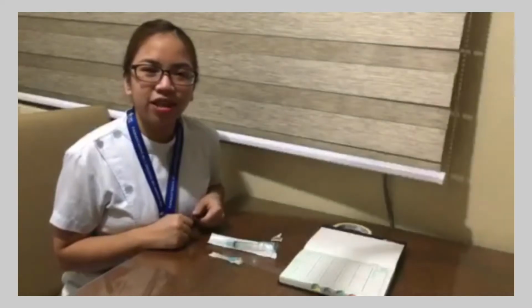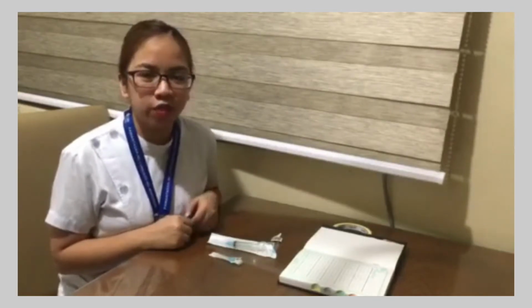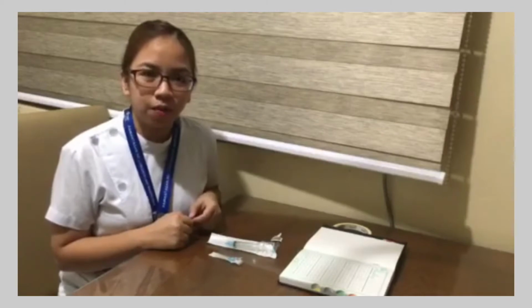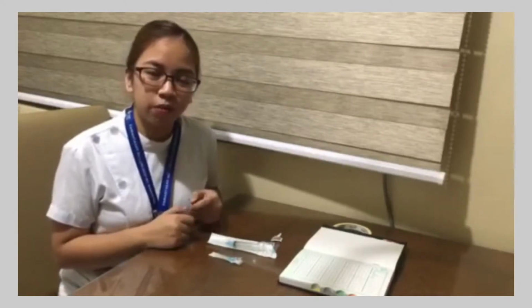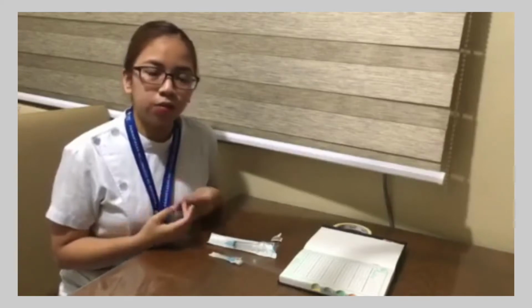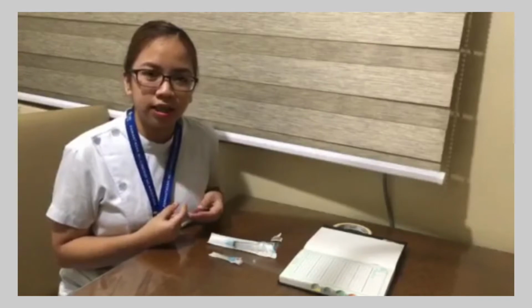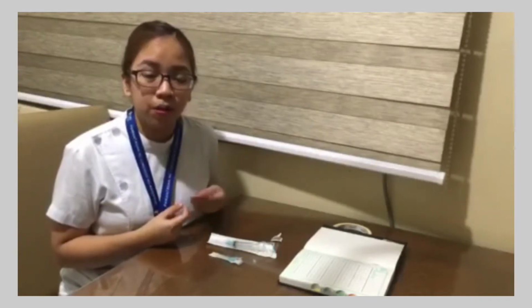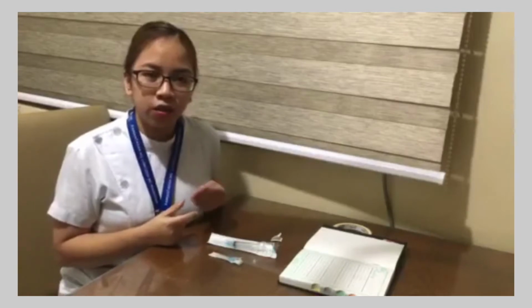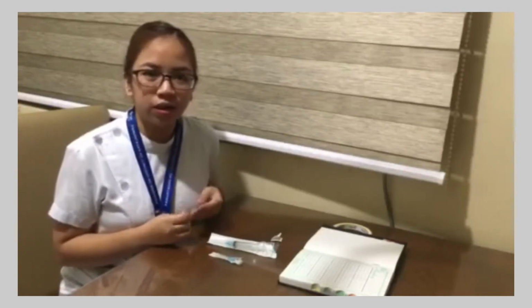Hi, I'm Daniel Hershey's Espelita, and today I'm going to perform preparing of medication from a vial. A vial is a small glass container with a rubber-sealed cap, and it comes in different sizes, from single-dose to multi-dose vials. Several drugs, such as penicillin, are dispensed in powder form. Thus, liquids such as sterile saline or water must be added, and this technique is called reconstitution.